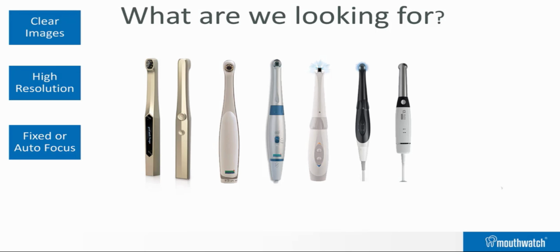Now, the difference between fixed focus and autofocus is that with autofocus, it chooses an object and then the camera automatically focuses on that focal point. So this is what you see on your phone. When you're taking a picture, you'll see it picks an object and it kind of goes in and out of focus until it zeroes in on that specific object.